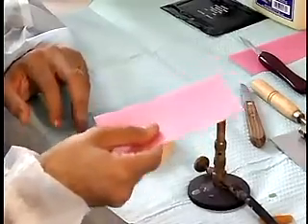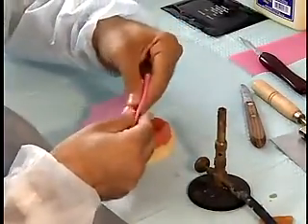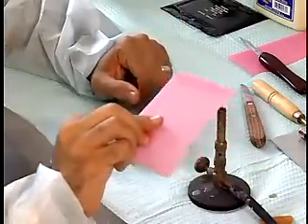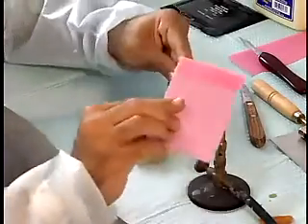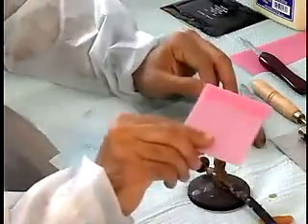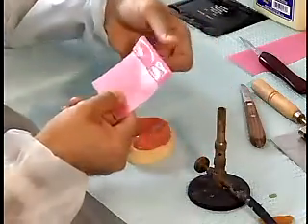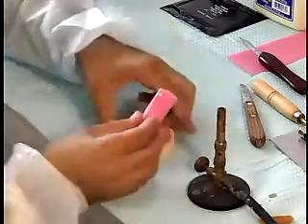Uniformly soften a sheet of hard pink baseplate wax. Flame the wax in a Bunsen burner flame slowly by passing the wax quickly through the flame many times. When the wax is thoroughly softened, fold the wax. Continue to flame the wax to soften it. Repeat the folding and warming until the entire sheet of wax is used.